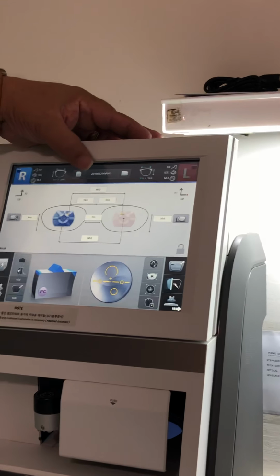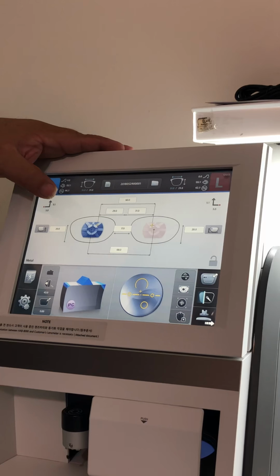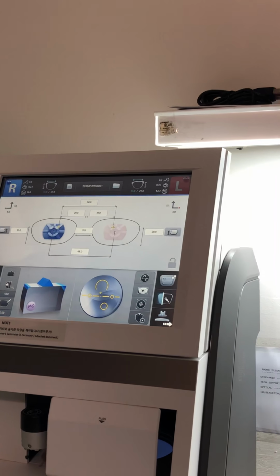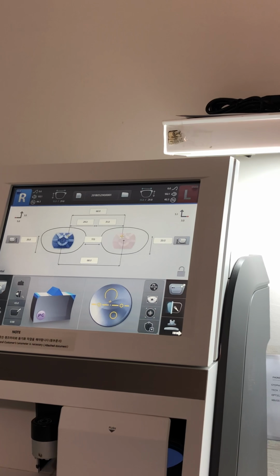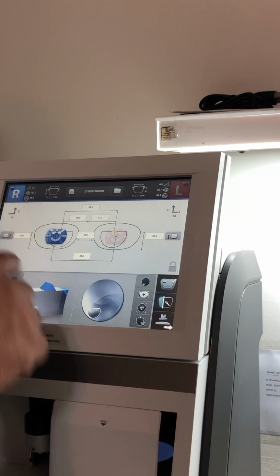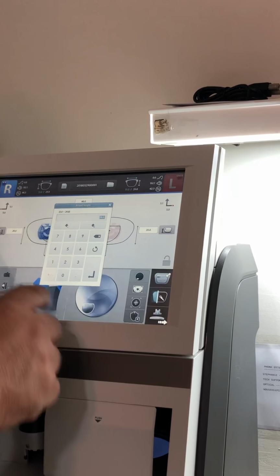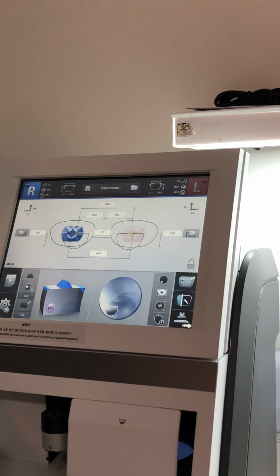This right here, this is our segment height. These are our PDs right here. This is our heights for segment height. Yeah, that is correct. Segment height for bifocal, fitting height for progressive. If it was a bifocal, then it would be what's my segment height? What's my bifocal height? Whatever it is, whatever's written on your paperwork.